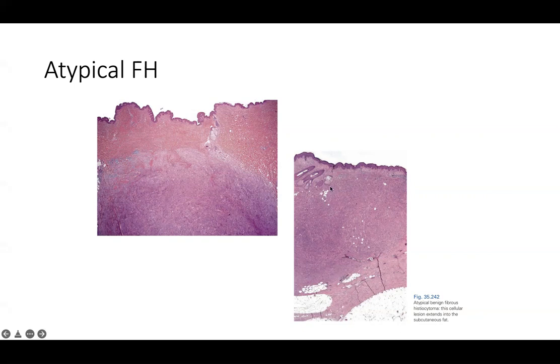Up here, you almost have these pseudo-adipocyte-like changes, and so that can become confusing too. If you've got some areas like this, where you've got these small little pseudo-adipocytes that are just little vesicles within the tissue, little areas of fluid-filled extracellular fluid that just got removed during processing, you're left with these little adipocytes. You can also have pseudo-lipomatous changes within a lot of different neoplasms. So that can make it pretty difficult if you just got this sample to say I'm not dealing with a DFSP, because you might think that this has completely obliterated the fat. So these can be pretty tough, and you really have to correlate with excision.